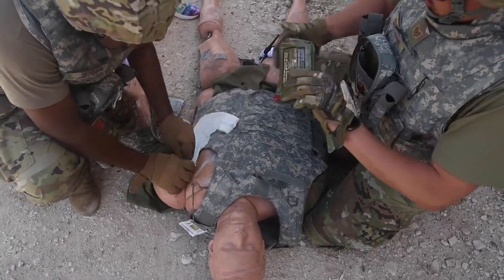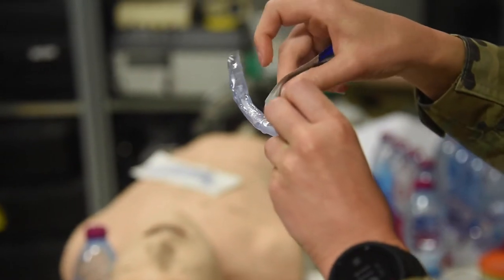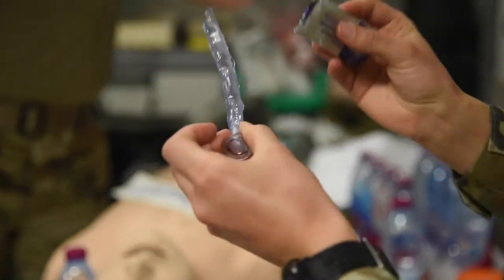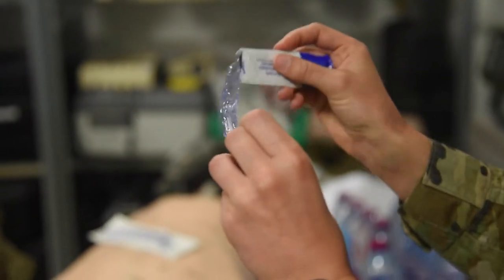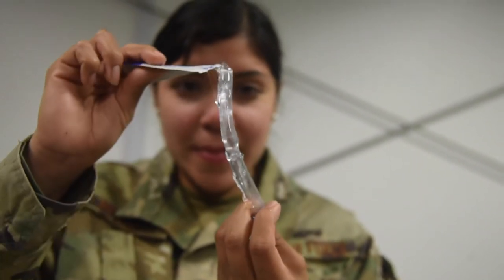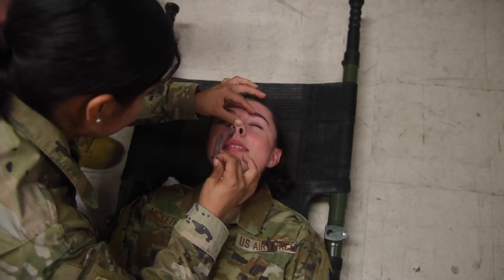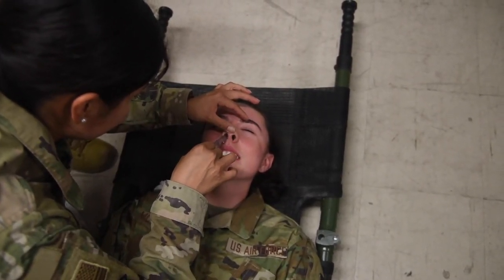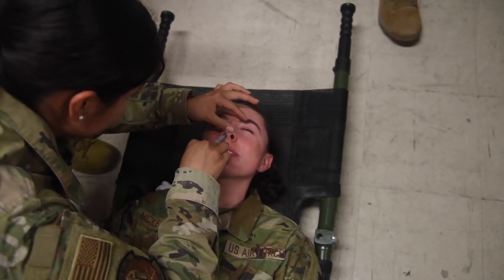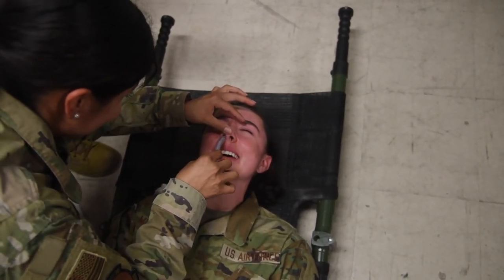Get your stuff out ready to help him. He's got bigger nostrils though. There you go — that hurts. Get closer. Oh God, that hurts. You want your number?